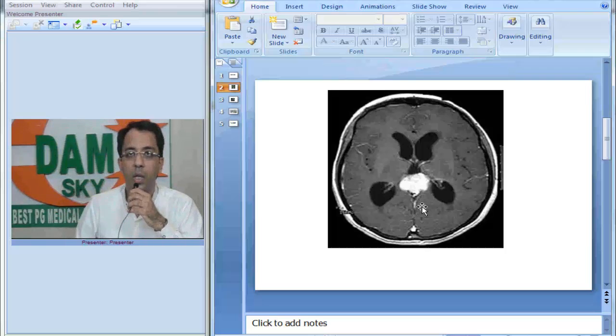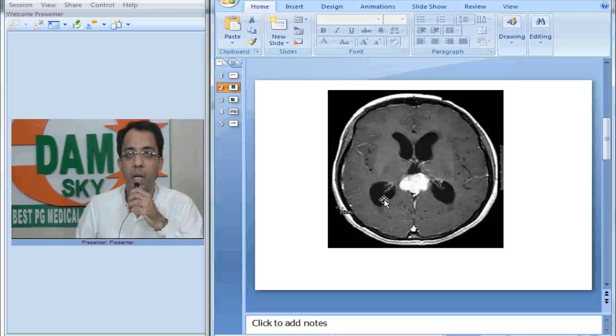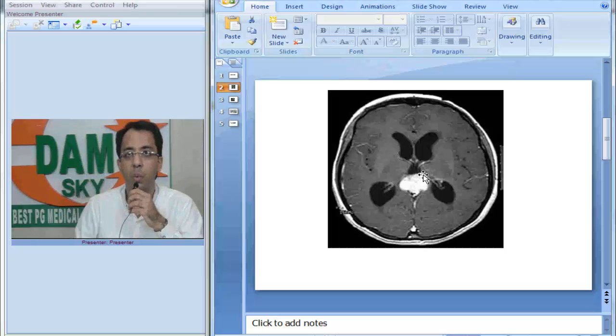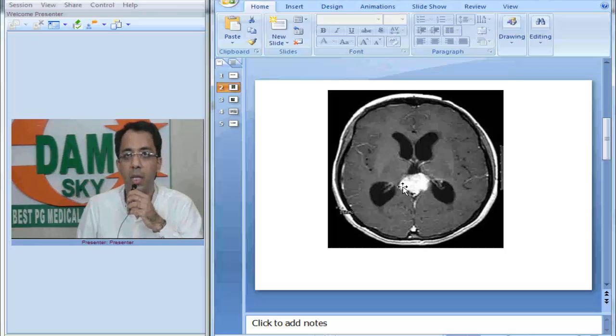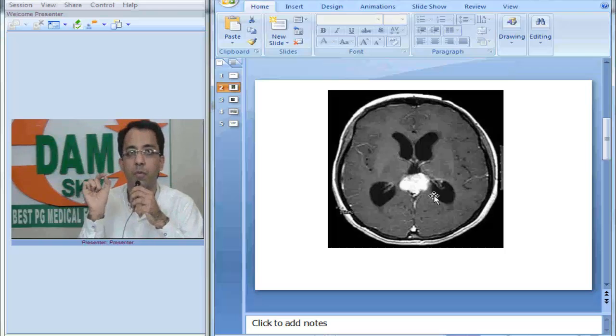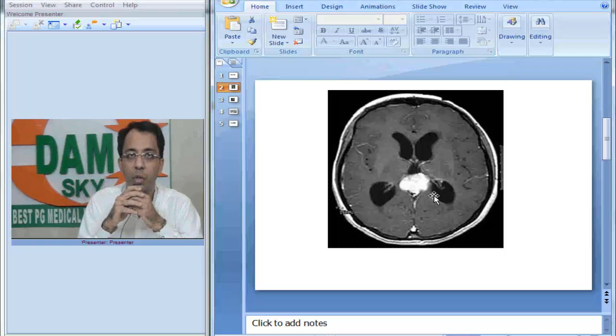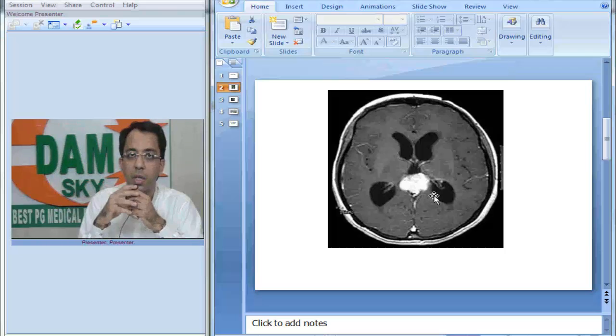When you look at this image, you can appreciate dilatation of both lateral ventricles and third ventricle appears ballooned out, and there is a homogeneously enhancing mass in the posterior part of the third ventricle. So what do we think of it? What is our diagnosis right now?